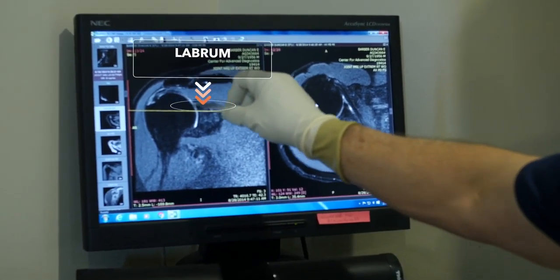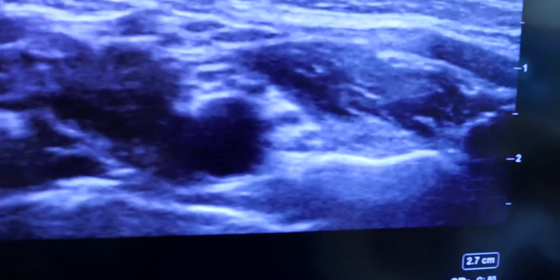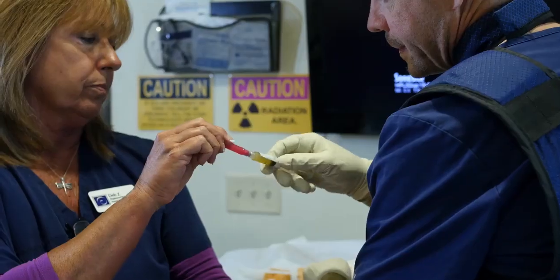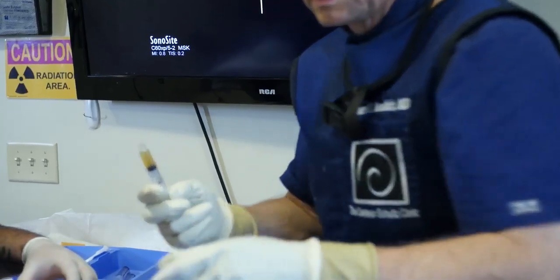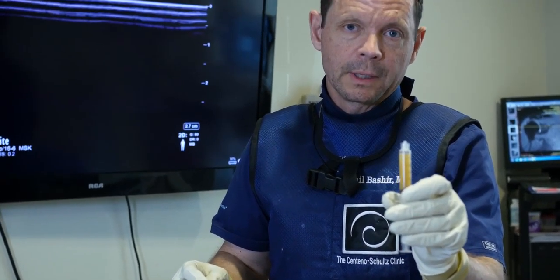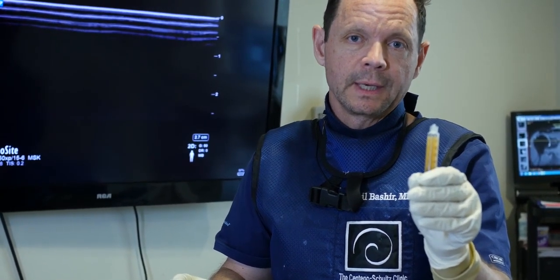His labrum has a tear in the superior anterior portion. These all can be treated effectively with accurately placed stem cell or platelet therapy. We're using a very specialized concentration of platelet — notice its color, it's amber, as opposed to many PRP solutions made by non-Regenexx provider clinics. This one is relatively free, or low concentration, of both red and white blood cells, which can be extremely inflammatory. The Regenexx difference is eliminating these specific cells through utilization of a state-of-the-art lab.